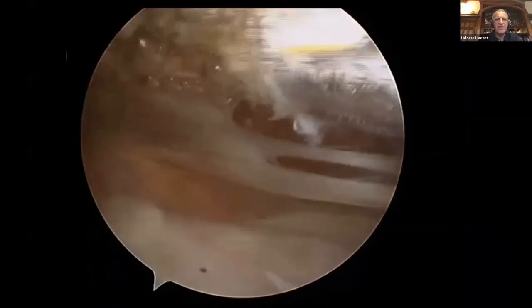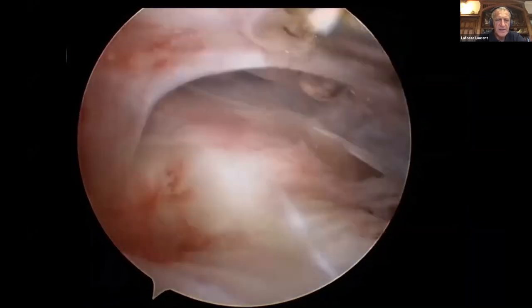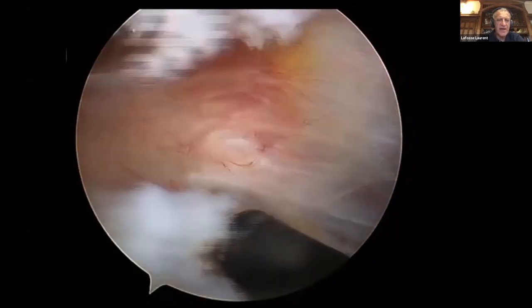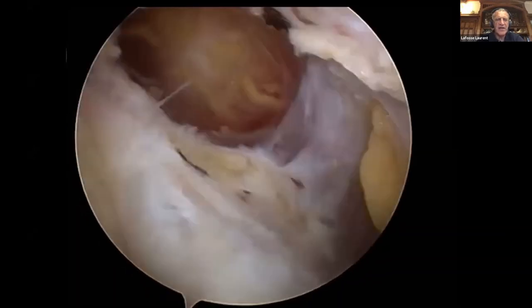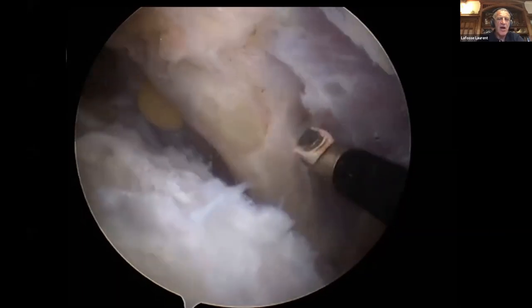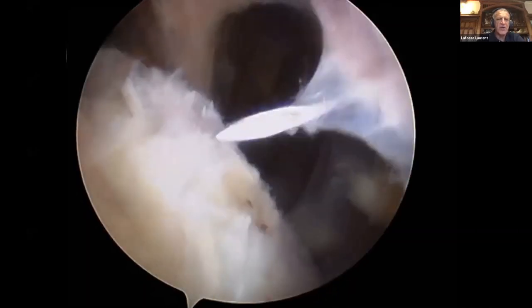This shows the transition from the subacromial space to the subcoracoid space. We're in the subacromial space. There is a fascia that separates the subacromial space from the subcoracoid space, and this is where you find and follow the coracoid ligament, and where you open the rotator interval. When you do this, there is a communication between the intra-articular, subacromial, and subcoracoid spaces. The subcoracoid space is limited by the tendon. You can even open the fascia further to go to the subpectoralis space, creating communication between every space, allowing you to insert your anchors and perform the repair.